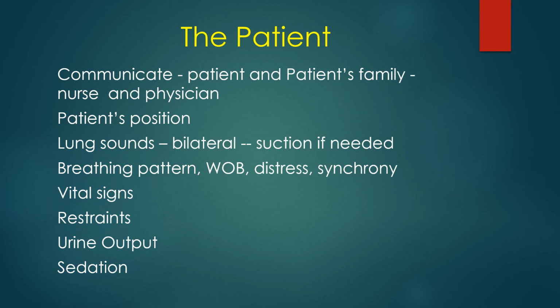Okay, now, as we started this, I said you want to think that you're not just monitoring the ventilator, you're also monitoring the patient. So you're going to want to communicate to the patient, ask him how his breathing is. You can say, do you feel like the machine is helping you breathe enough? Or questions like that. The patient can often tell you a lot more than all those numbers on the machine.